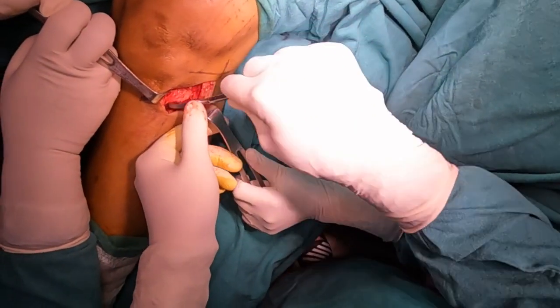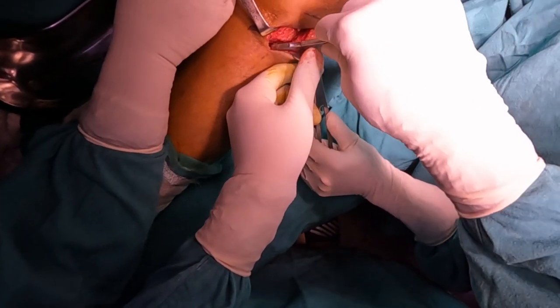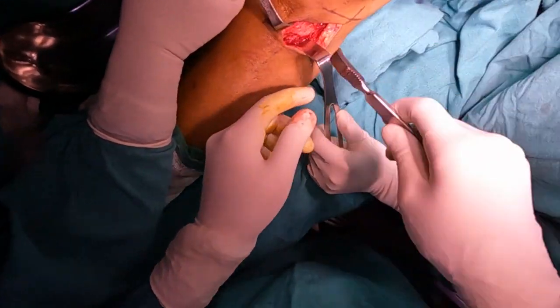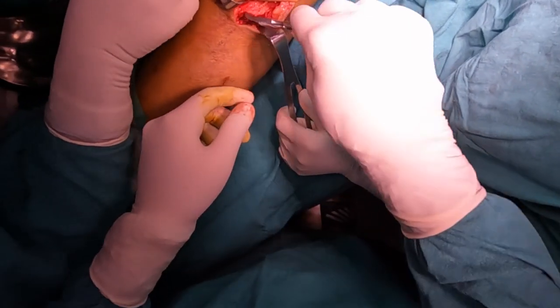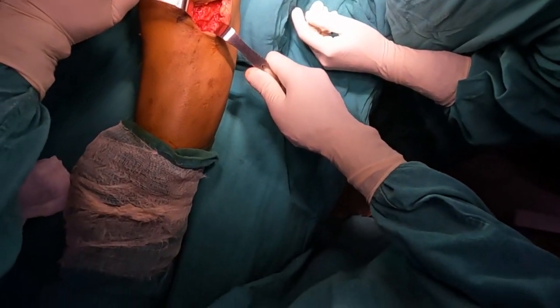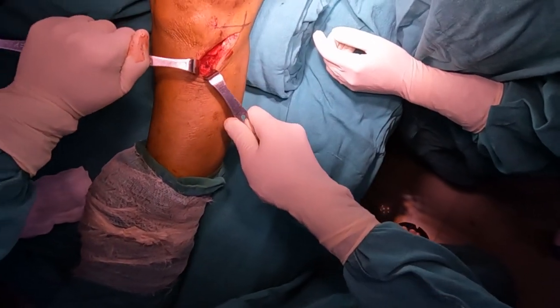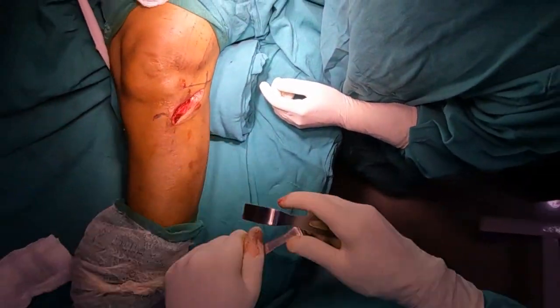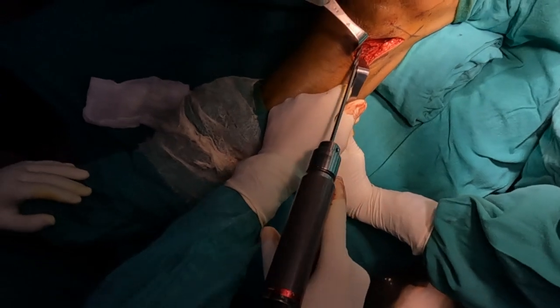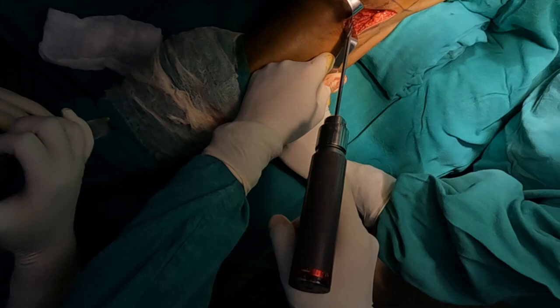Next, using a periosteum elevator, we carefully release the anterior compartment musculature from the lateral aspect of proximal tibia to expose the metaphyseal cortex. To achieve reduction without arthrotomy, we create a cortical window in the lateral plateau metaphysis using a 4 mm drill bit.